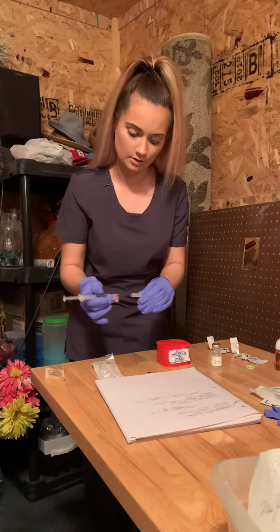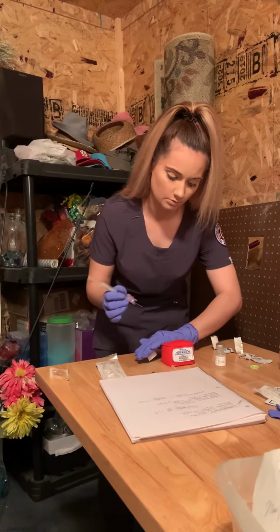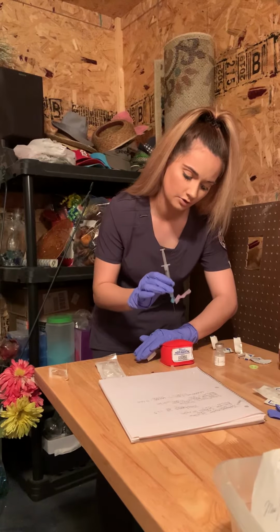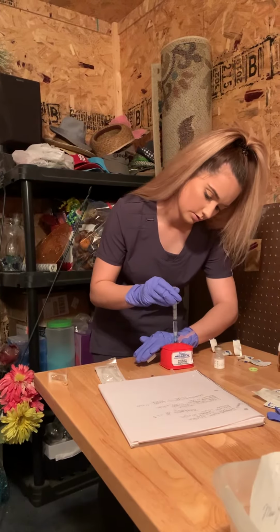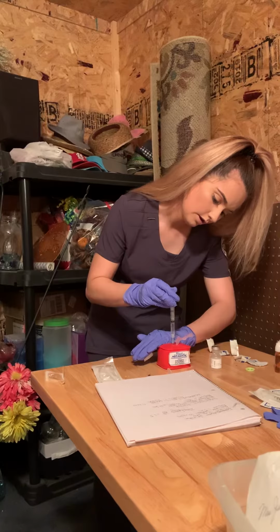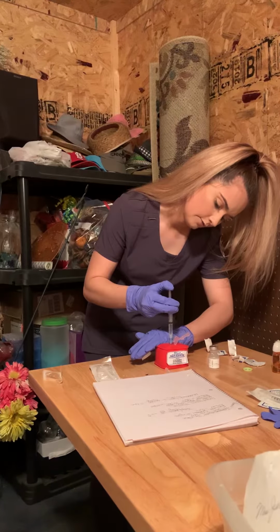So I would take the cap off my needle. I would palm down, pull the skin. You want to do a 45 to 90 degree angle. Just go straight in. And you will want to aspirate 5 to 10 seconds to make sure there's no blood coming in. If there's not, you can slowly inject the medication, 1 milliliter every 10 seconds.